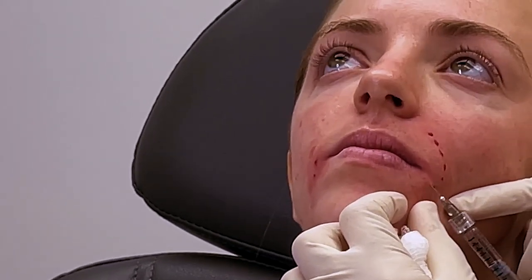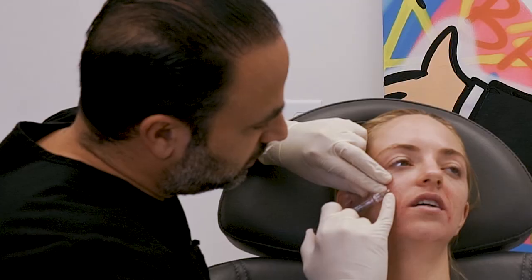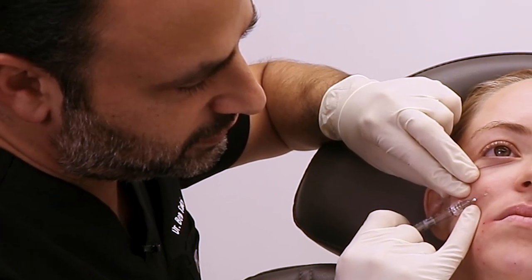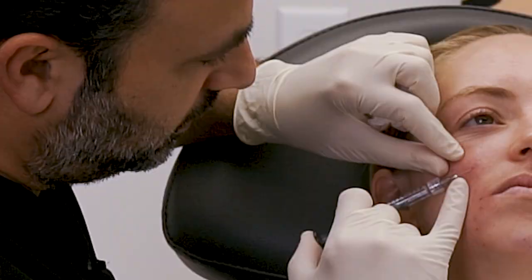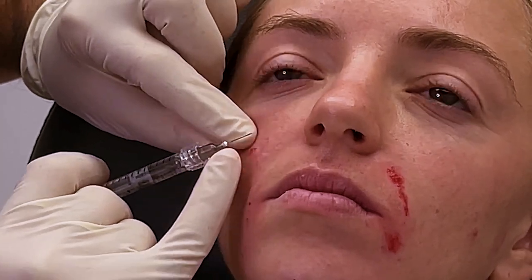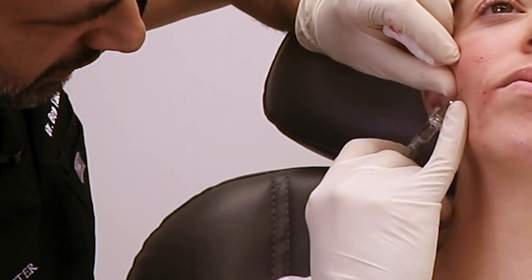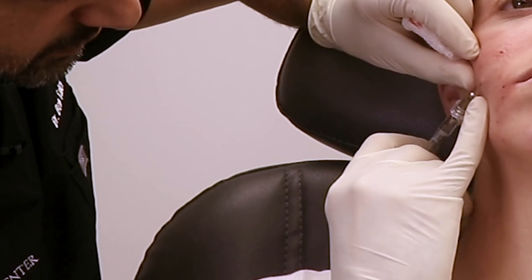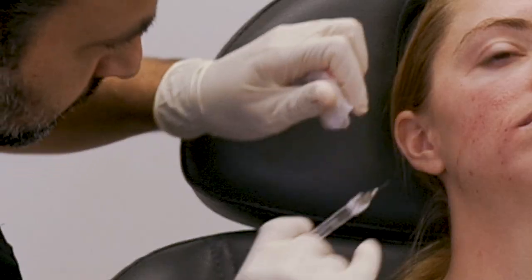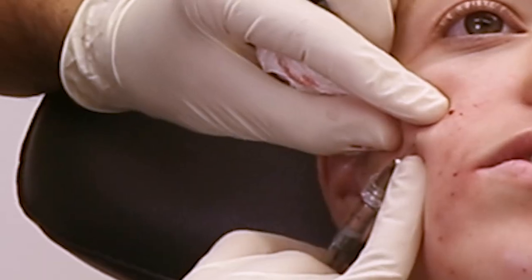If you hit into the alar crease, there's an inferior alar artery that tucks right under there and comes from here, wraps around. People inject it fairly commonly and never know — it doesn't always cause a visible problem. I've done so many lip lifts and I've seen it cannulated with little sausages of filler in the artery that have been there for years with no vascular compromise. She needs some neurotoxin to relax the strain. She has a strong modiolus so you don't want to do too much. Next we're going to inject a couple of the acne scars — it helps them when you plump them up right underneath.